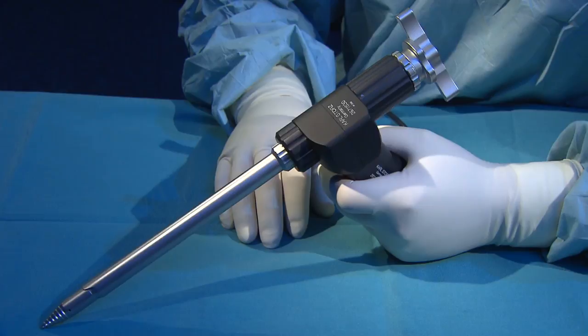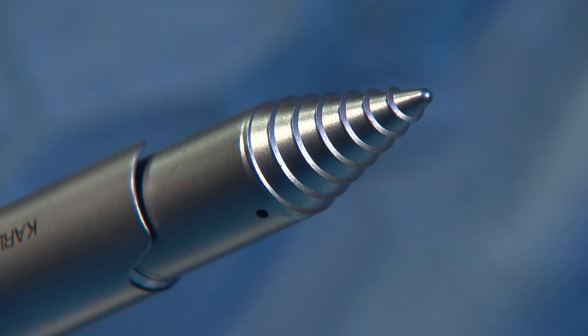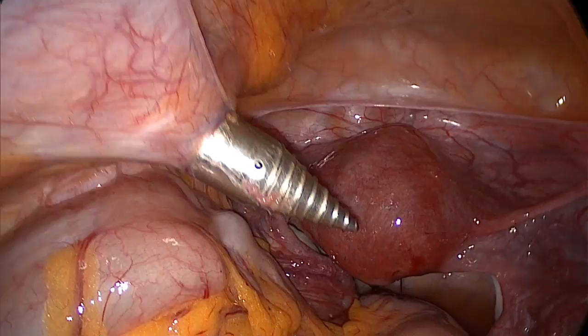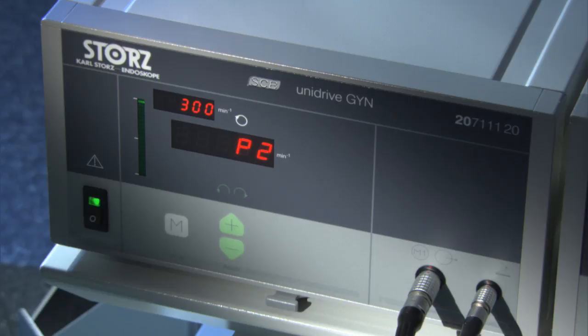The new screw trocar distends the fascia layers gently. The supercut morcellator is driven by the Unidrive Gein motor system. Up to 300 revolutions are pre-programmed in program 2. Program 3 with up to 650 revolutions is recommended for particularly hard tissue.